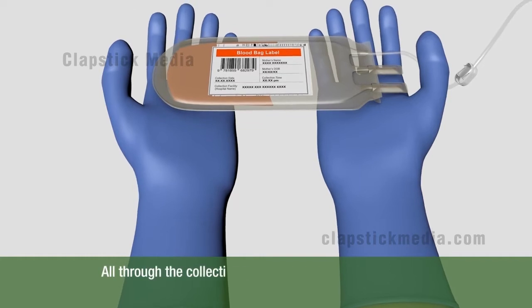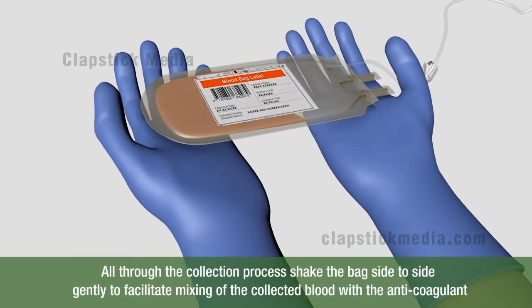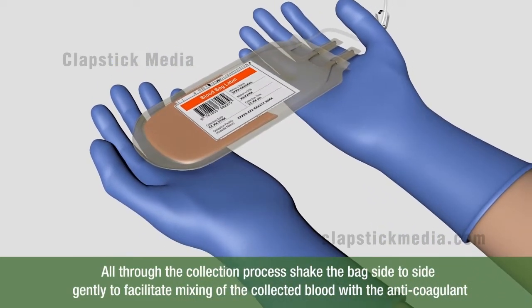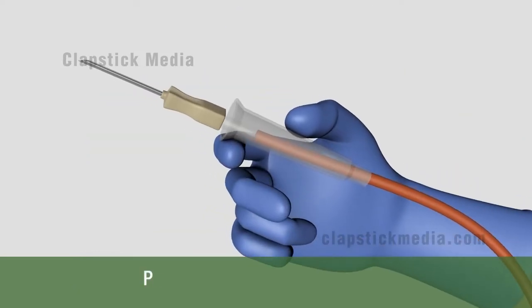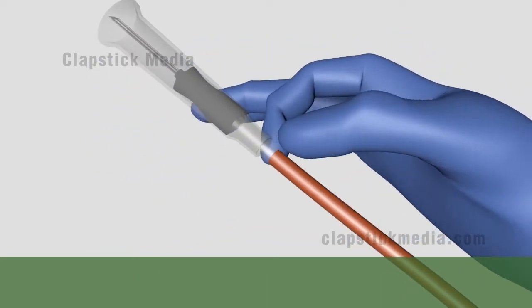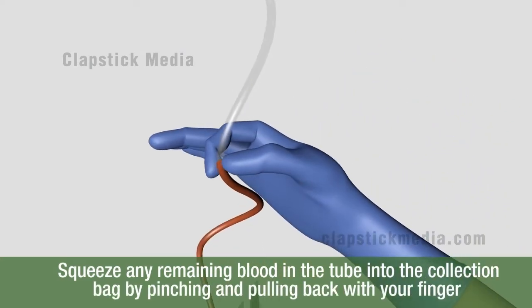It's important to note: all through the collection process, shake the bag side to side gently to facilitate mixing of the collected blood with the anticoagulant. Once the collection is complete, immediately pull the needle cover over the needle. Squeeze any remaining blood in the tube into the collection bag by pinching and pulling back with your fingers.